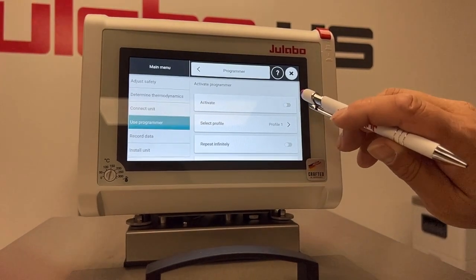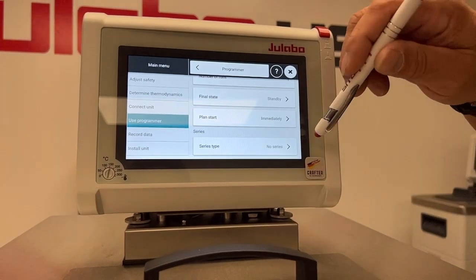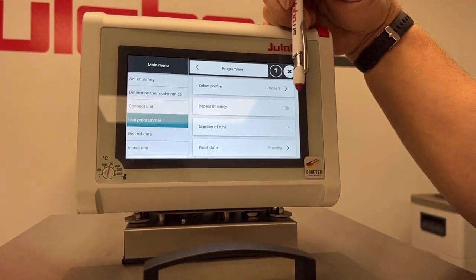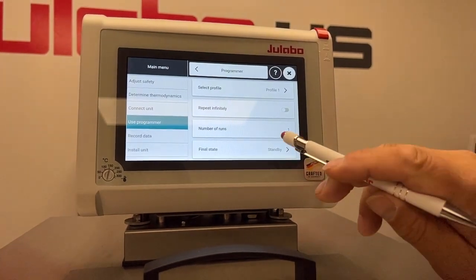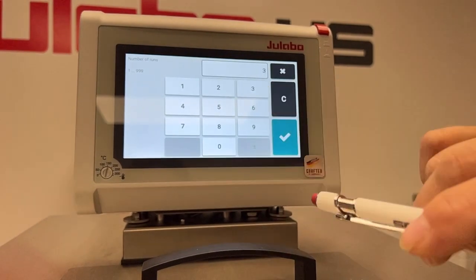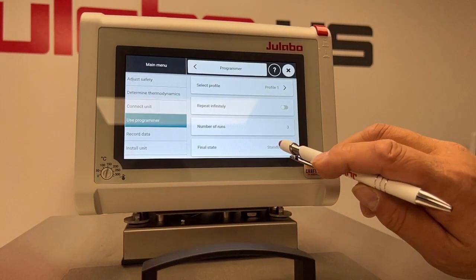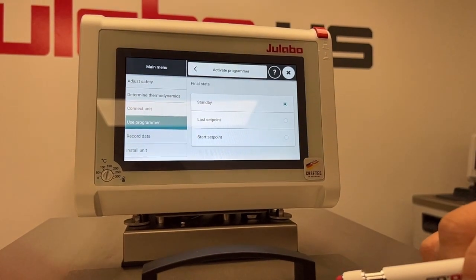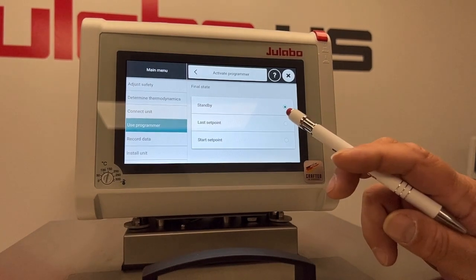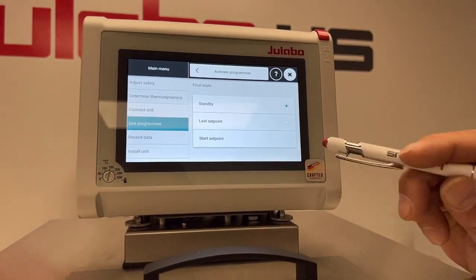So some other options: you have Repeat Indefinitely, which would continue to run until you shut it down. Or you can have it repeat a certain number of runs — say you wanted to have it repeat three times. The final state can be changed from standby, which is what we're in now, to the last setpoint on the program, or the starting setpoint on the program.